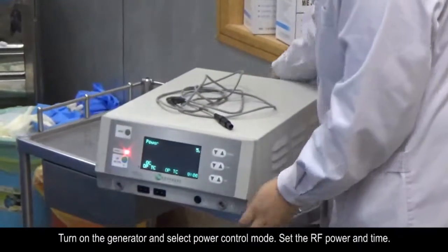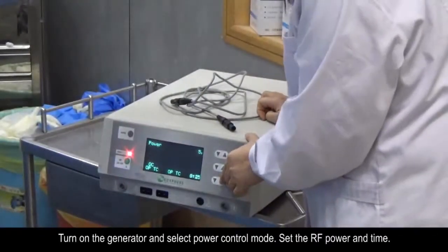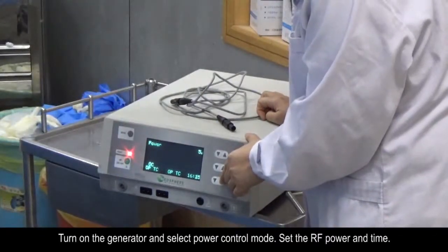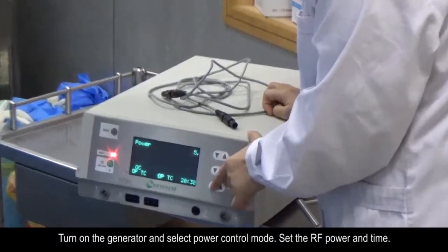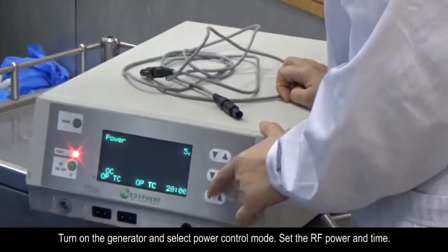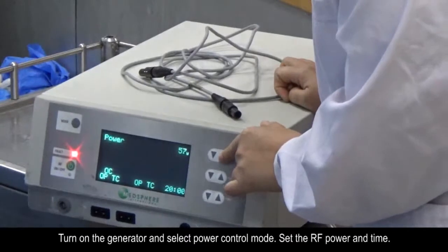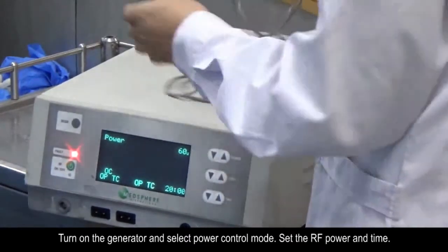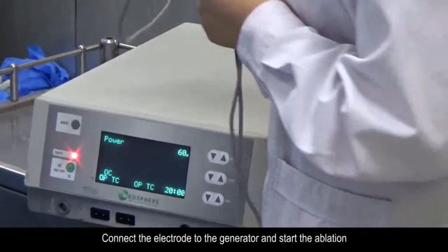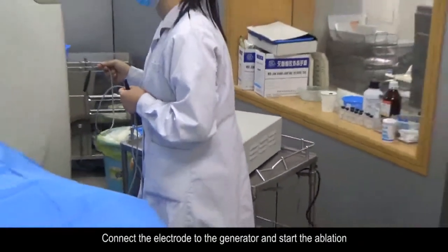Turn on the generator and select Power Control Mode. Set the radiofrequency power and time. Connect the electrode to the generator and start the ablation.